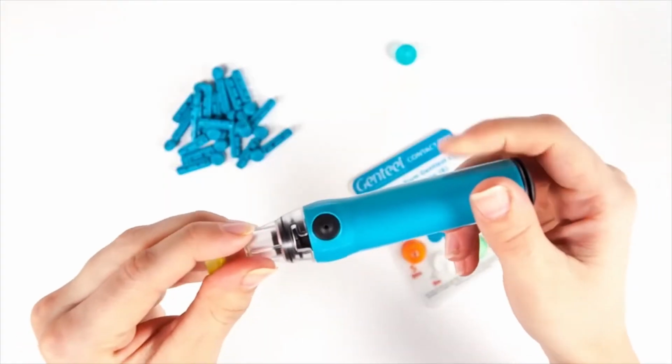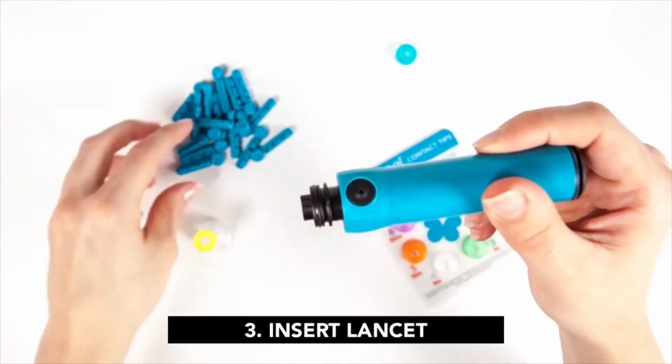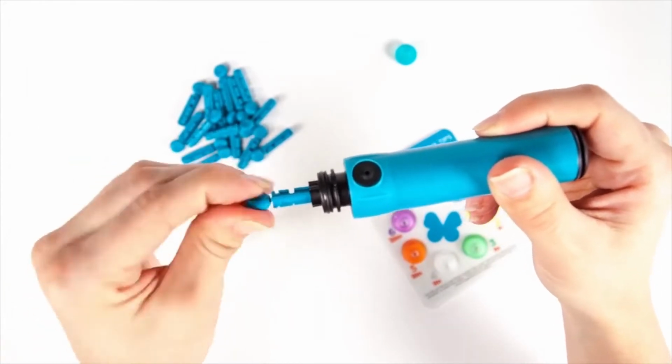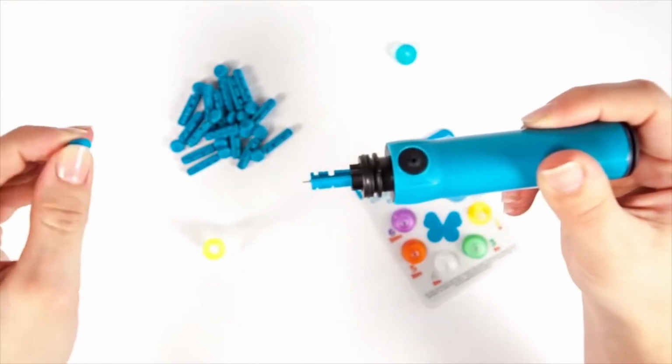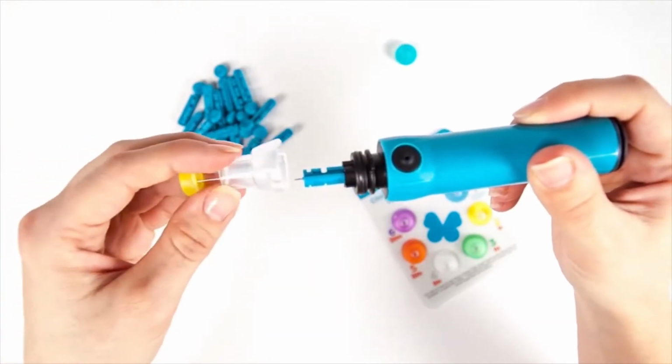Twist the nozzle counterclockwise, pull off, and place aside. Insert a butterfly touch lancet. Remove the lancet's protective cap, ensuring not to bend the needle. Place the nozzle onto Genteel, twist clockwise, and ensure it's secured.